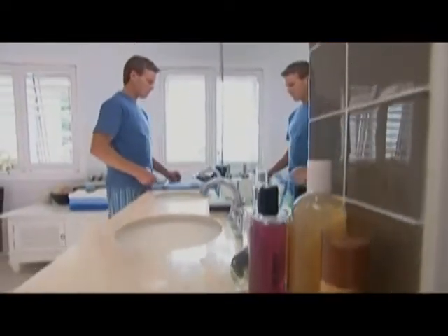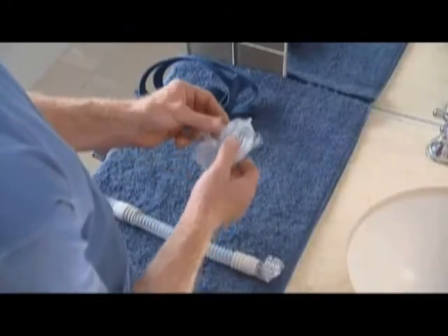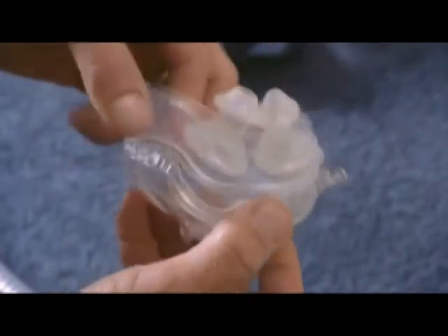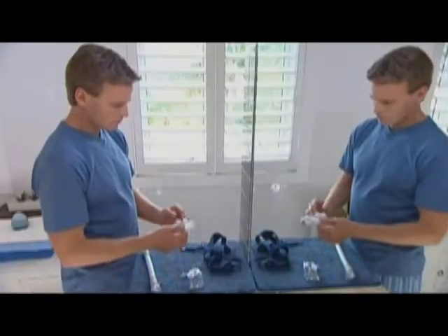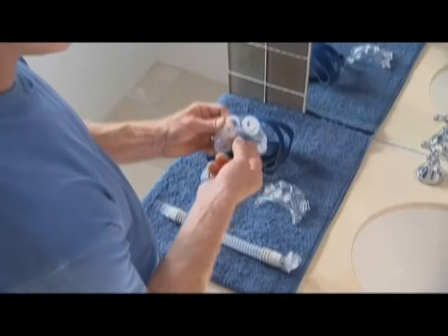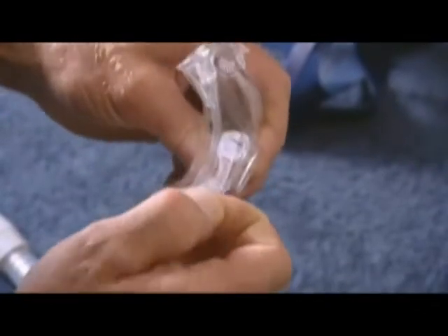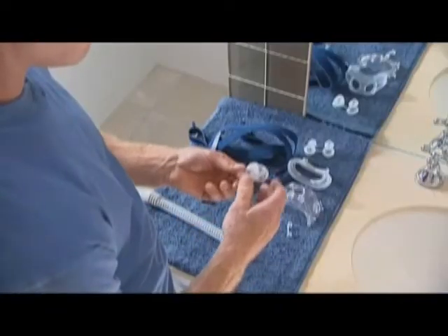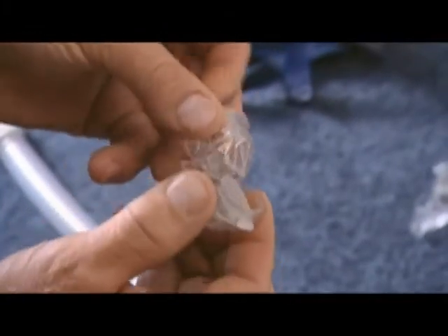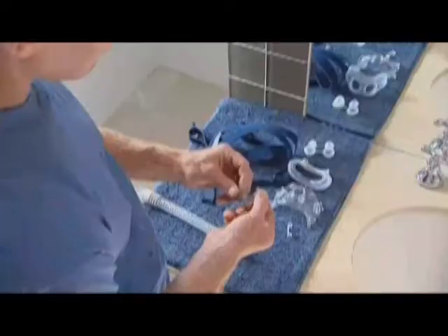In order to clean your Mirage Liberty Full Face Mask thoroughly, you'll need to disassemble it. First, detach the top straps of the headgear. Carefully pull the mouth cushion away from the mask frame. Push the two nasal pillows down through the mouth cushion. Remove the ports cap. Detach the short tube assembly from the elbow. Using the protruding edge, remove the valve clip from the elbow. Lastly, gently peel the valve from the valve clip.